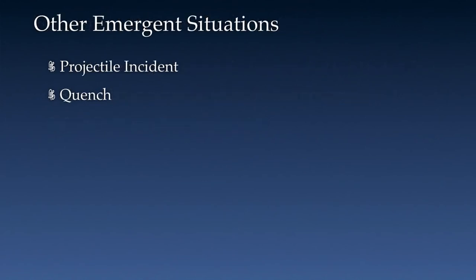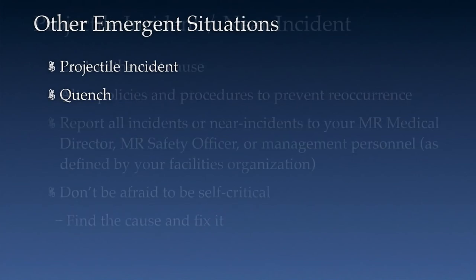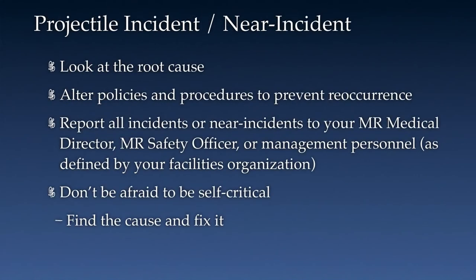Other emergent situations include projectile incidents and a quench for superconducting systems, of course. When a projectile incident or near incident occurs, we need to look at the root cause of the incident and alter policies and procedures to prevent a reoccurrence.